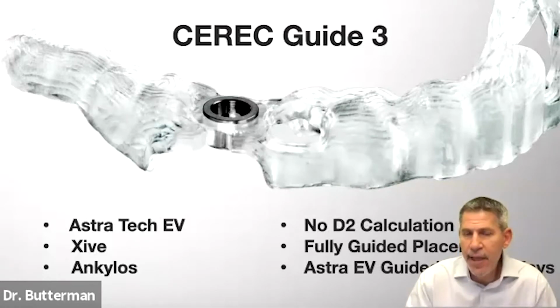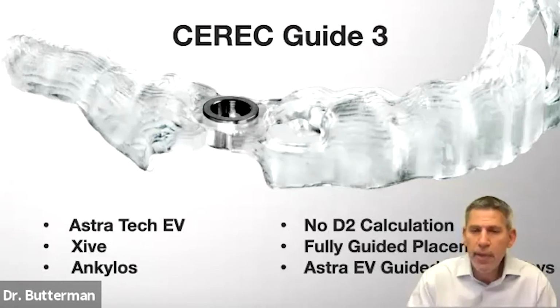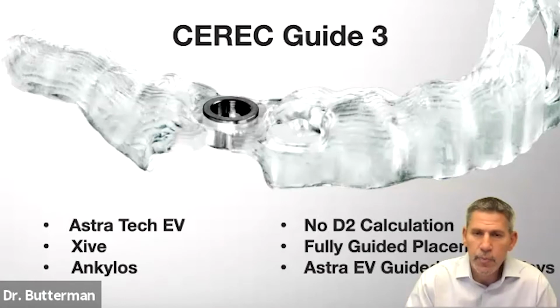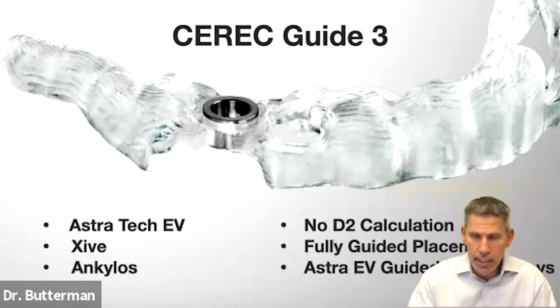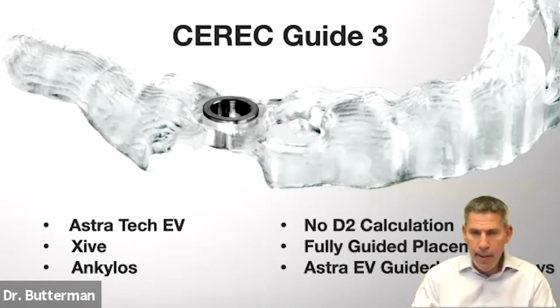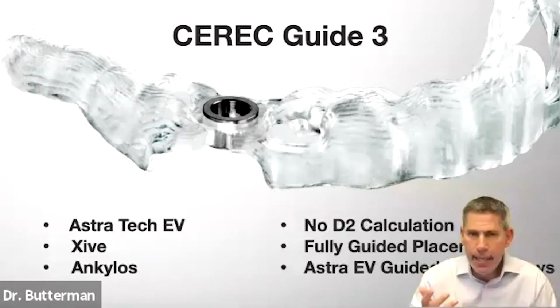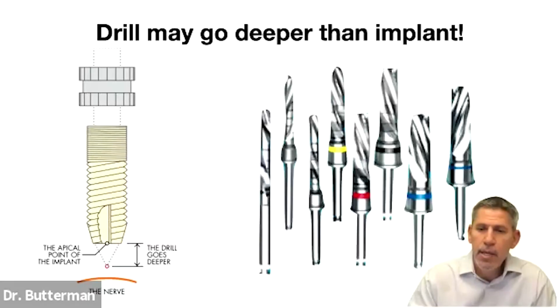But the advantage of the CEREC Guide 3 is that I'm able to do a fully guided osteotomy and fully guided implant placement, and I don't need to use keys. I can do a keyless surgery, and that makes it really, really convenient. If I'm doing a CEREC Guide 2, then I do need to use keys, and it's only a guided osteotomy. I have to place my implant freehand.